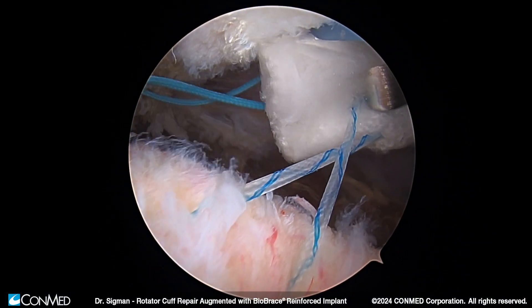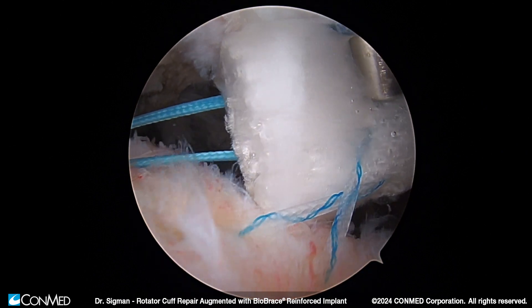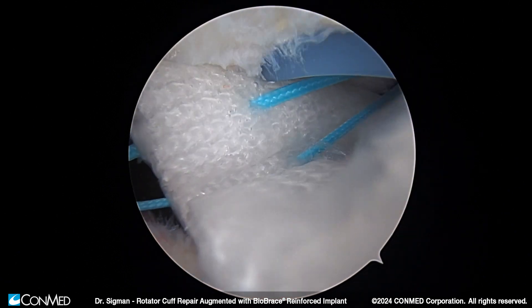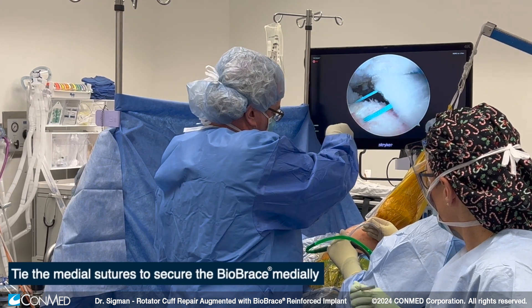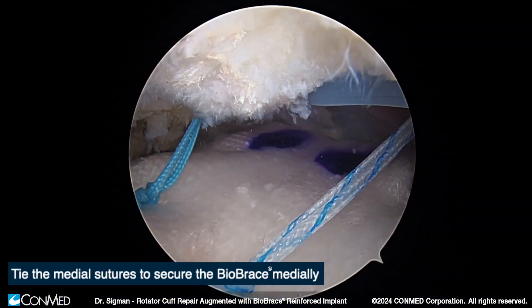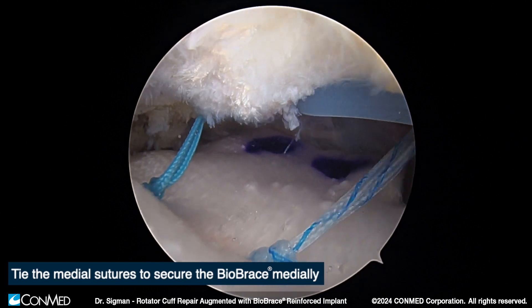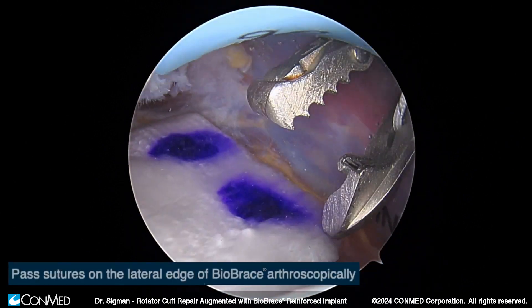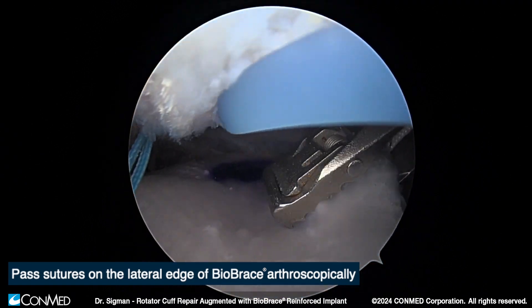You can see a grasper to push the implant in. Another technique is to use a knot pusher with all four suture limbs up and through the knot pusher as you center the graft and place it into the shoulder in the subacromial space. We then go ahead with arthroscopic medial row knot tying — anterior and posterior. This fixes the rotator cuff to the footprint medially, but also fixates the implant to that area as well for later tensioning.